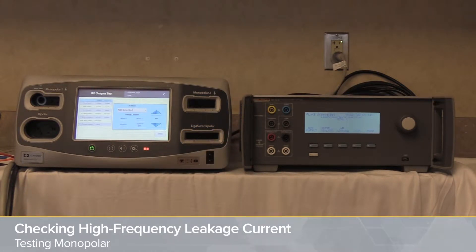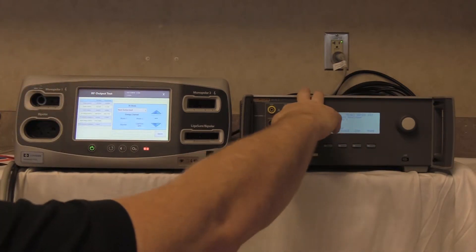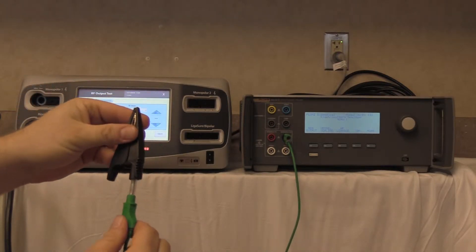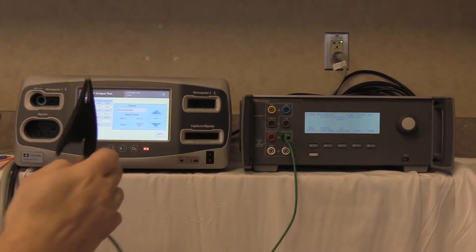Step one is to connect the green ground wire to the variable low of the QAES-3. We then attach the black alligator clamp and connect it to the ground lug on the back of the FT10.